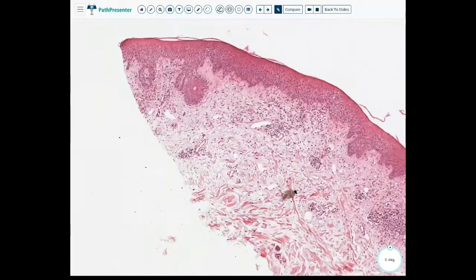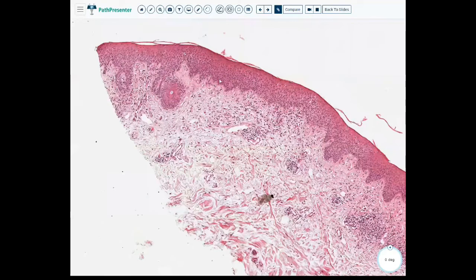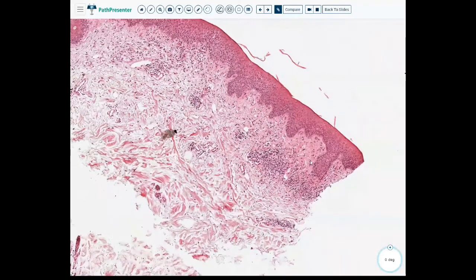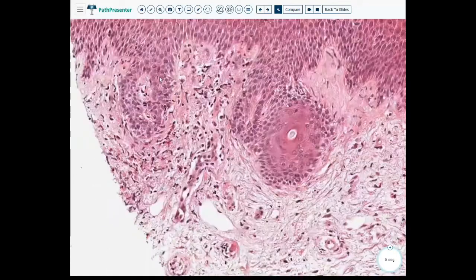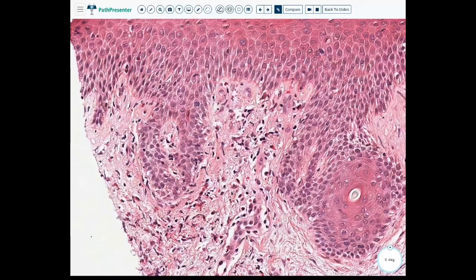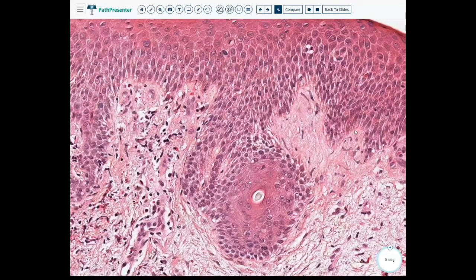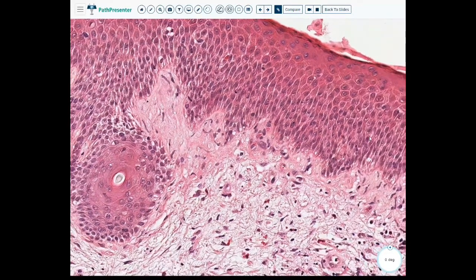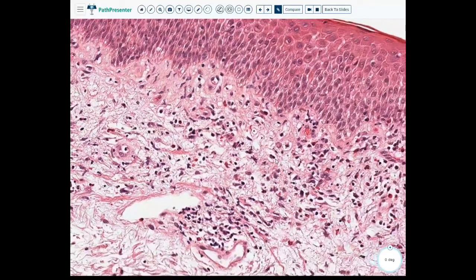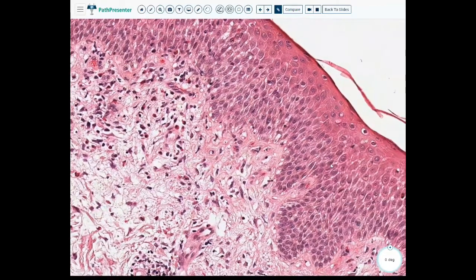And again, we're not really appreciating any hyperkeratosis in this, but again, there is acanthosis. This is thickened. This one looks a little more irregular maybe, and there is also maybe some superficial dermal inflammation. Look at all those eosinophils though, wow. Lots of those. Again, acanthosis, we have the spongiosis again, like you can even make out those spinous processes within this lesion. Lots and lots of eos, just look at that. Very reactive. So this is another example of eczema.